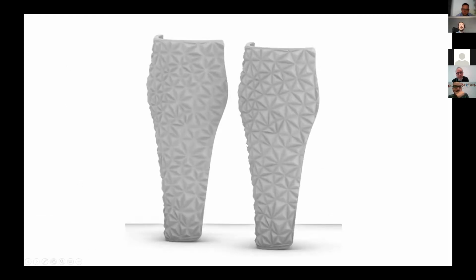And we have options for applying a more tri-dimensional pattern in this case, which of course results in quite sharp edges. So one can apply some mesh smoothing to this as well to round out any very sharp corners that might lead to stress concentrations or just a worse look overall aesthetically.